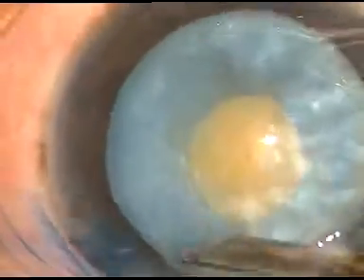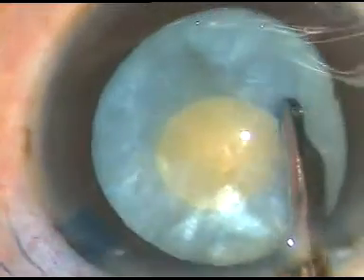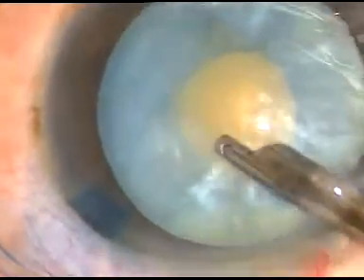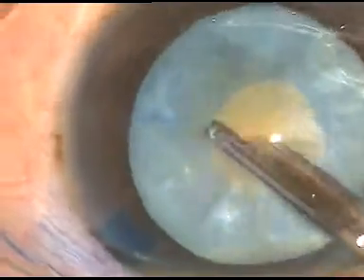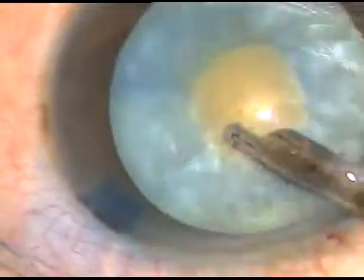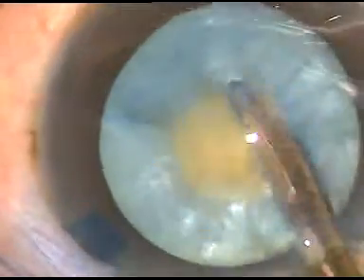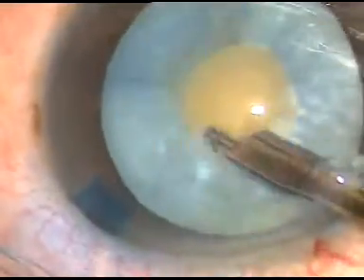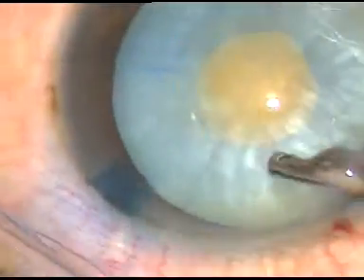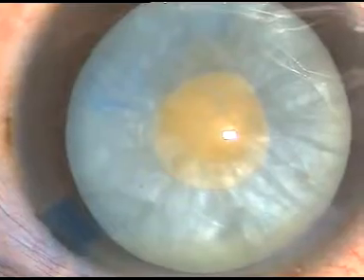I squeeze the lens matter and try to push it from the equatorial region to the rhexis site. A lot of cortical matter need not be aspirated. If we aspirate some amount of cortical matter, that is fine. In this case, I could not remove much cortical lens matter.